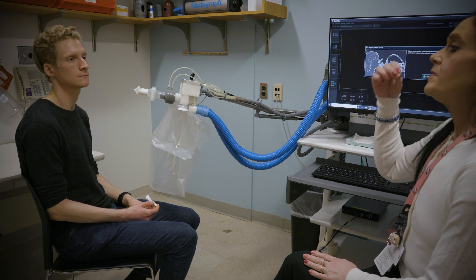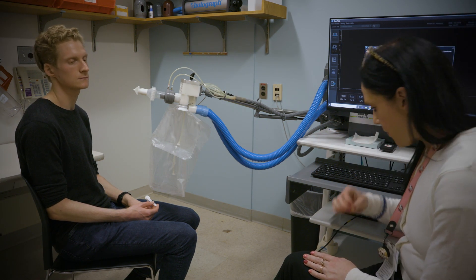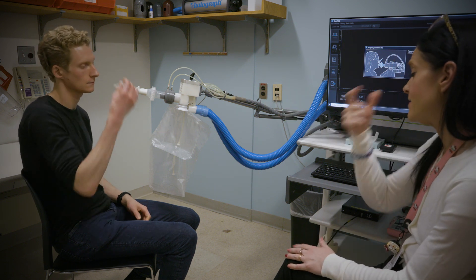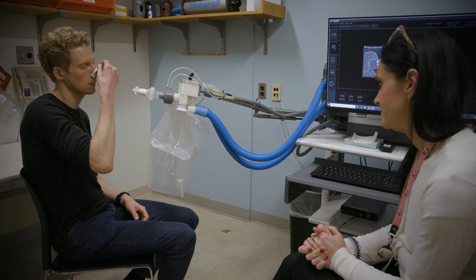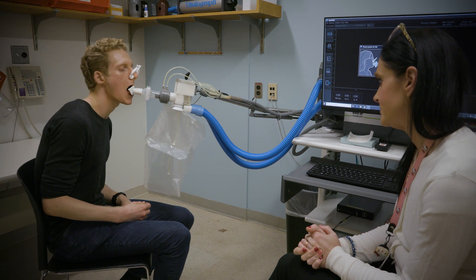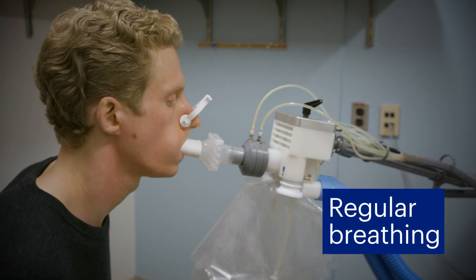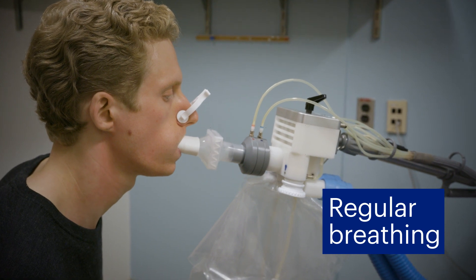This next test is called the helium test. This test measures the maximum amount of air in your lungs and how much air is left after slowly breathing out. You will start by breathing in and out normally for several minutes.